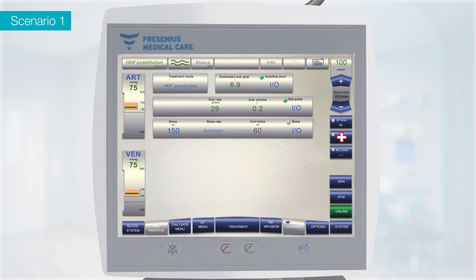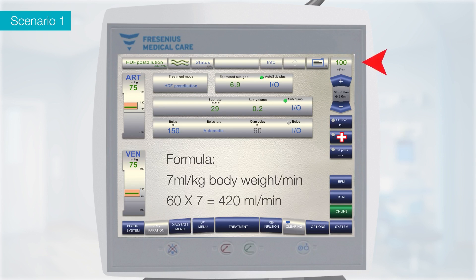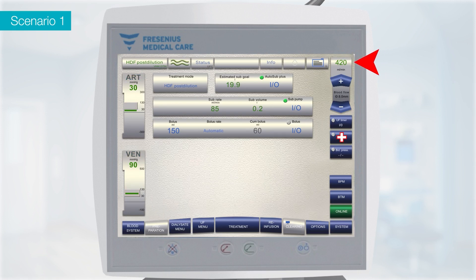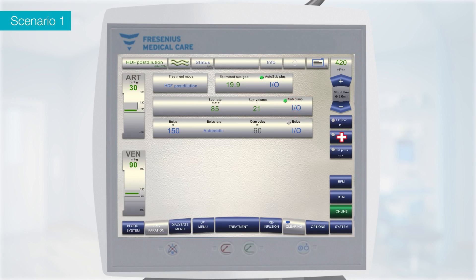Auto-sub-plus is auto-activated upon selection of HF or HDF treatment by default. Calculate the BFR required for this patient using the formula: 7 ml/kg body weight per minute. In this case, 60 multiplied by 7 equals 420 ml/min. So increase the BFR to 420 ml/min. Auto-sub-plus software will automatically calculate the substitution rate. Initially the substitution rate will be lower, but as soon as the TMP stabilizes, the substitution rate will change automatically. Observe the substitution goal estimated by the machine. Substitution volume should be at least 21 litres so that the patient will get a total convective volume of 24 litres or more.